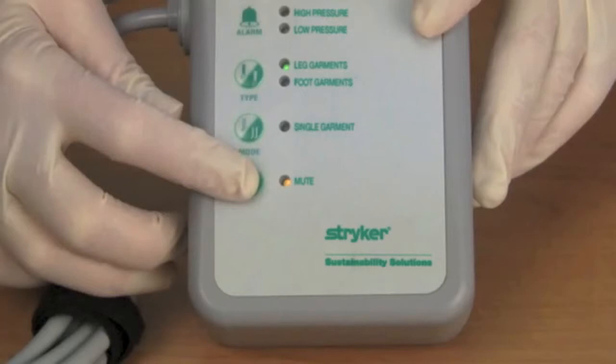If the alarm persists after garment change and 5 cycles, remove the pump from service and notify your facility's biomedical department. The mute key silences the audible alarms for 3 minutes, at which time it will re-engage to notify the user of future alarms.